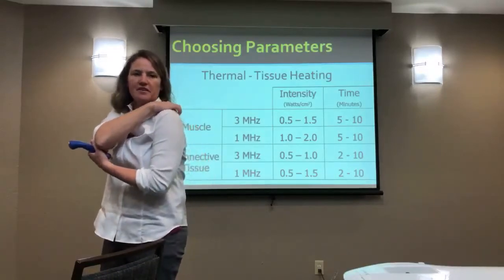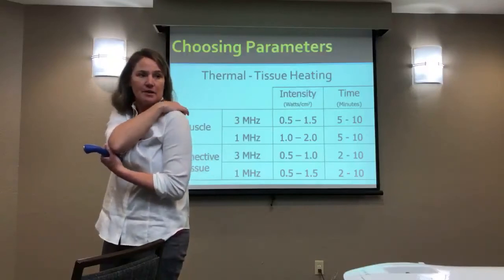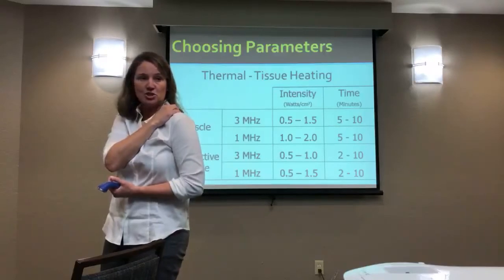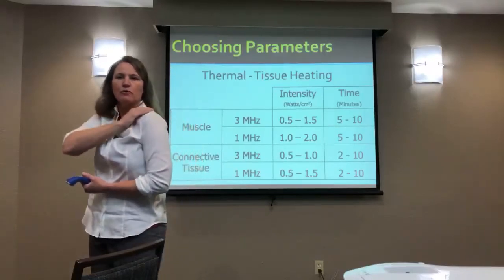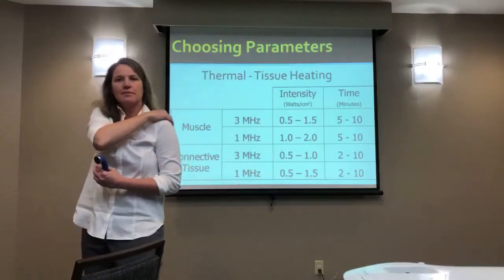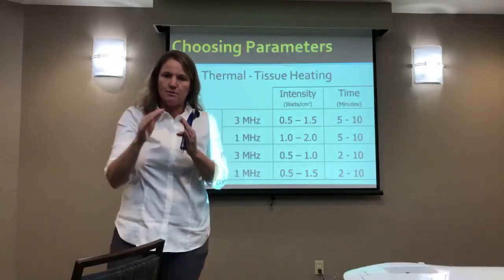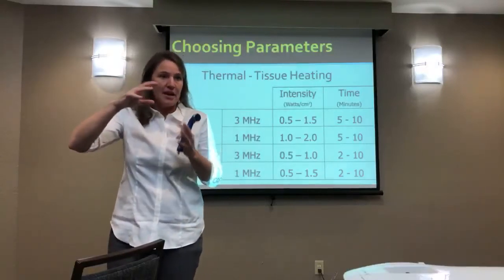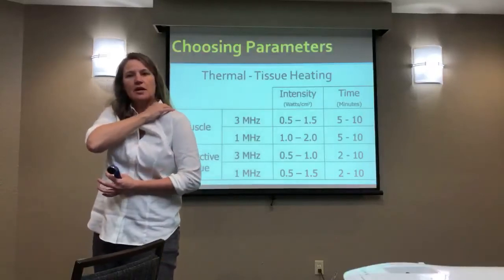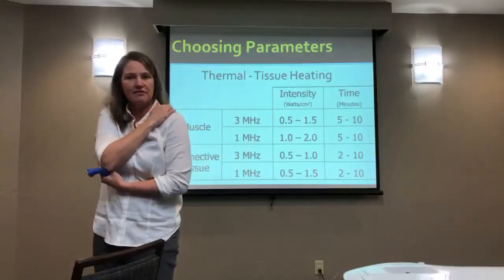So you have a very superficial area with your scapula, the spine of the scapula. And then you have a relatively deep fossa with a lot of muscle tissue in it. You can't move over both those areas and expect to make both spots happy. So if I'm treating an area, I want to try to get my target to be as light in depth and tissue as possible. Because if I'm just moving around up here, it's either going to be too intense for the bony area or not intense enough for the muscular area.